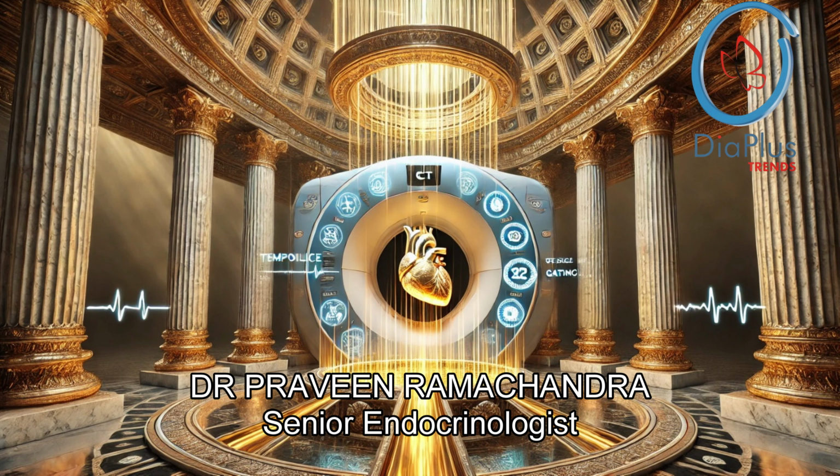And then they also use iterative reconstruction, which is sophisticated software that essentially cleans up the image, allowing for clearer pictures with less radiation. Lower radiation dose is always the goal. Absolutely. And then, of course, the contrast dye. Can't forget about that. The contrast agent helps to really highlight those arteries on the scan. It makes them stand out so you can see them clearly.